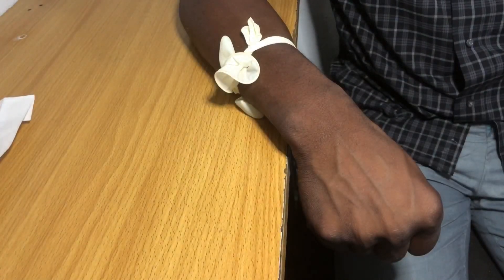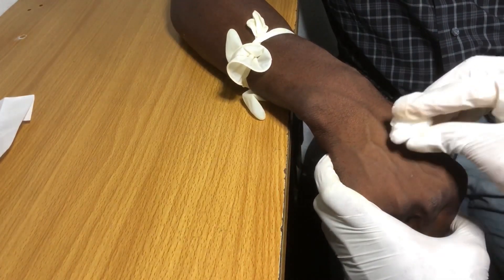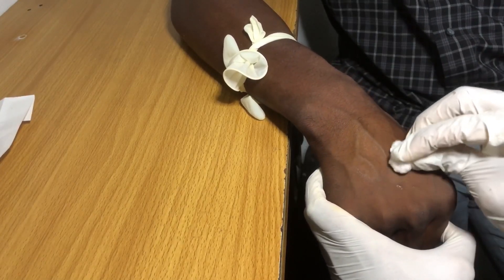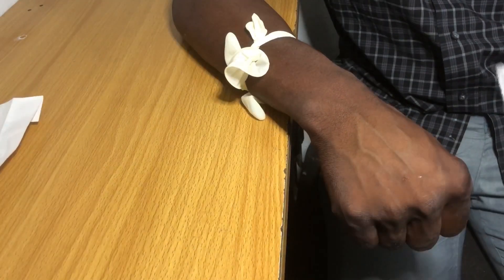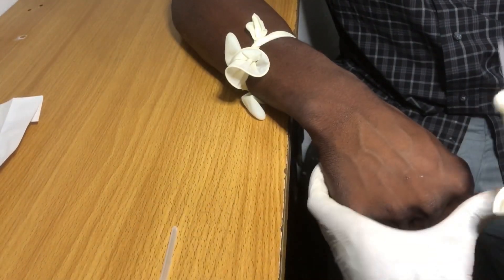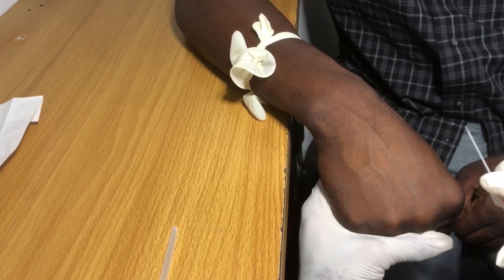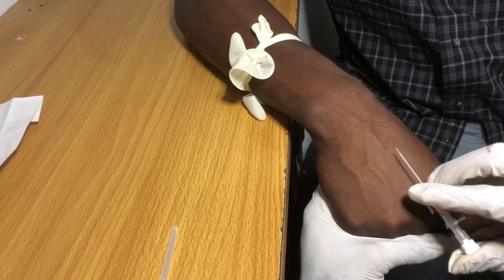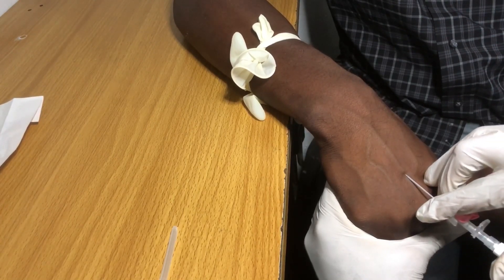Next, clean the area with an alcohol swab or cotton wool with spirit, wiping in a circular motion from the inside out so as not to reintroduce germs to the cleaned area. Then take out your cannula and roughly estimate if the vein can accommodate the full length of the cannula by placing it along the axis of the vein. During this process, make sure the cannula is aligned with the vein to reduce the risk of rupturing it from an awkward angle.